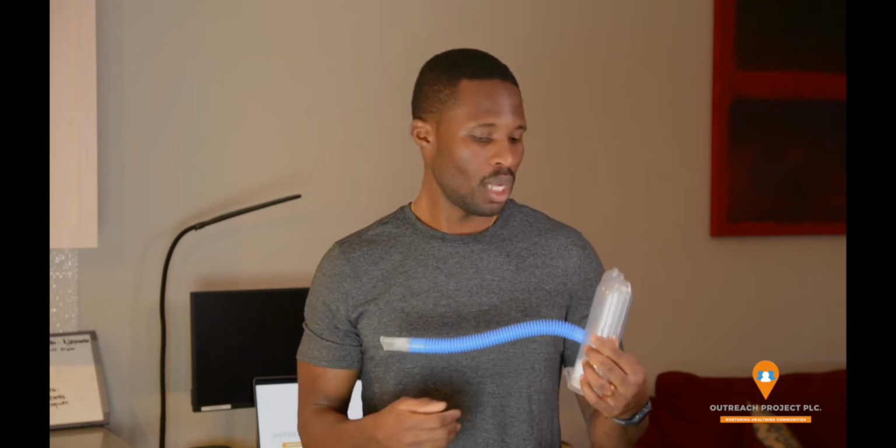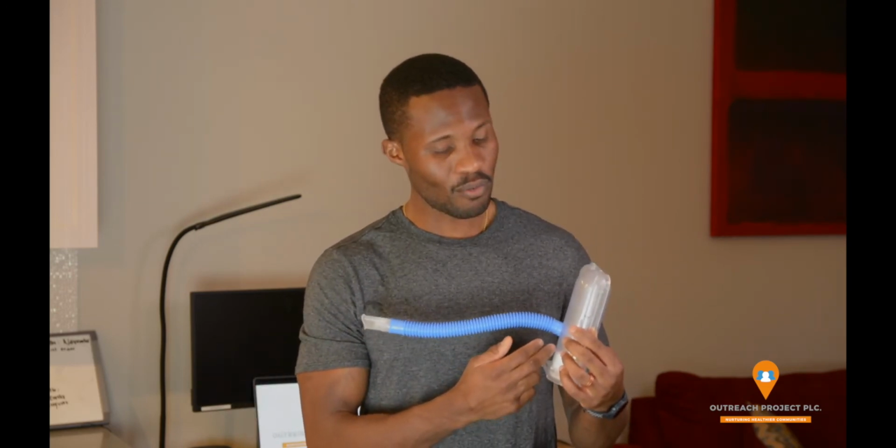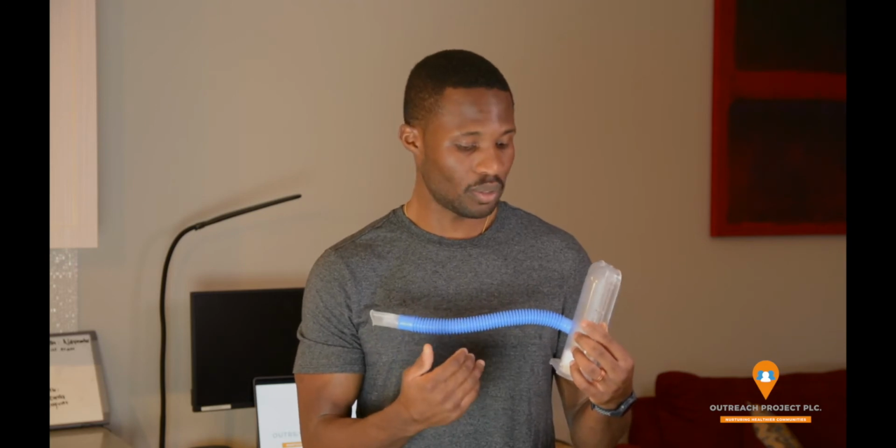What that tells us is that they don't have very good inspiratory capacity, so they're not able to inhale well. And what you might see even before you do this is that you notice they're taking very shallow breaths, so you already had an idea what that number might be. This just gives you an objective number and also gives the patient a visual representation of where they are with their inhalation.